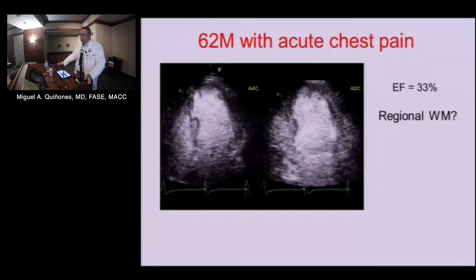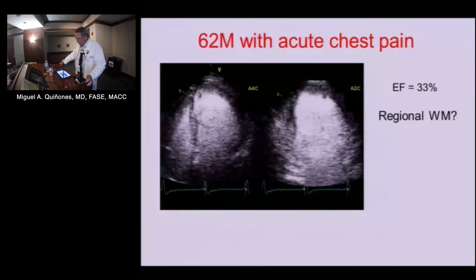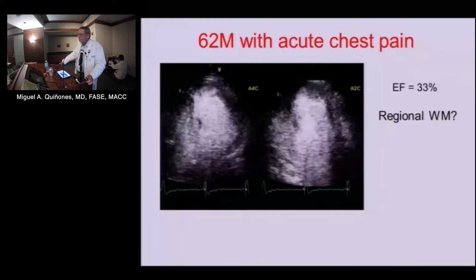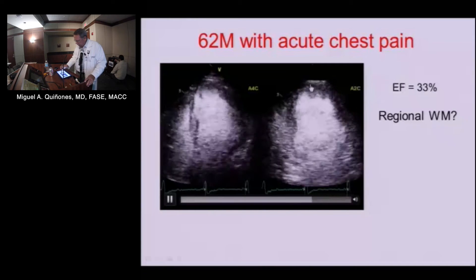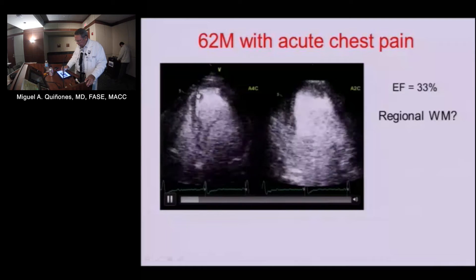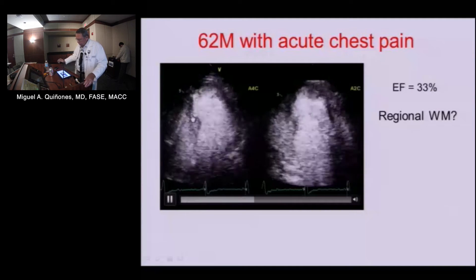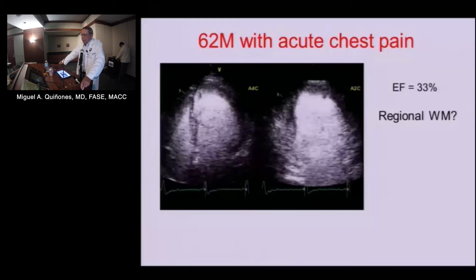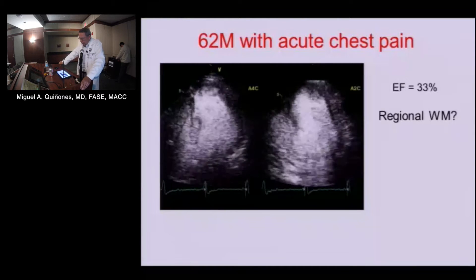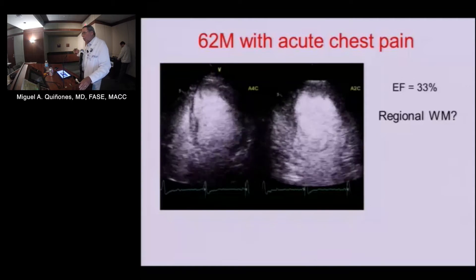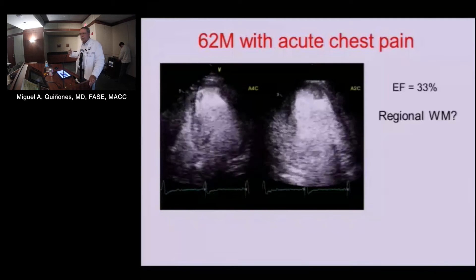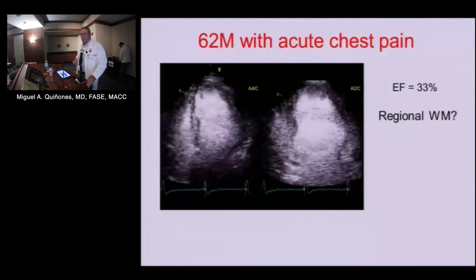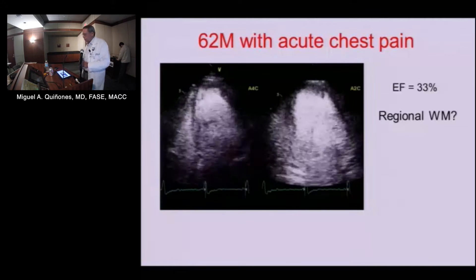Is this totally global or is there any regional dysfunction? It looks like maybe at the apex things are not doing much, and maybe at the very distal septum. Could this be a non-ischemic cardiomyopathy? Yes. Could this be a patient with ischemic cardiomyopathy with the apex being worse than everything else? Yes. So the presence of regional wall motion abnormality, although it increases the statistical odds of CAD, is not a slam dunk. Likewise, the absence of regional wall motion abnormality does not exclude CAD.